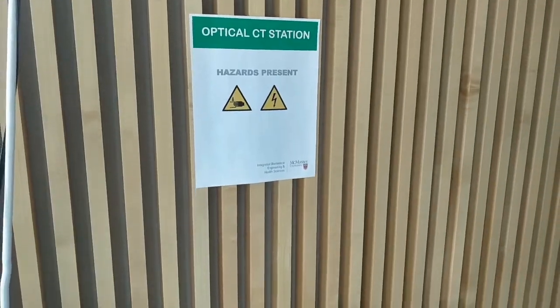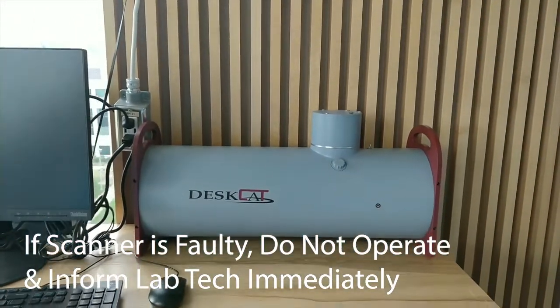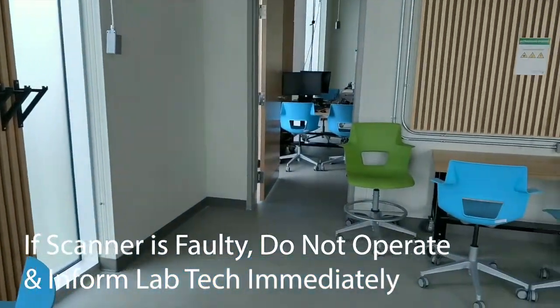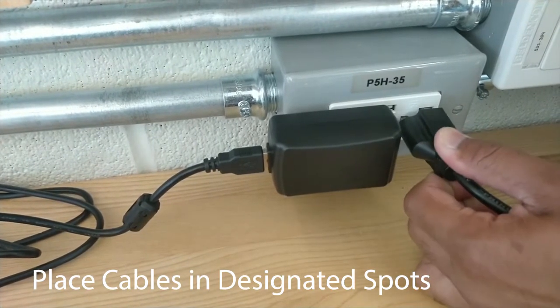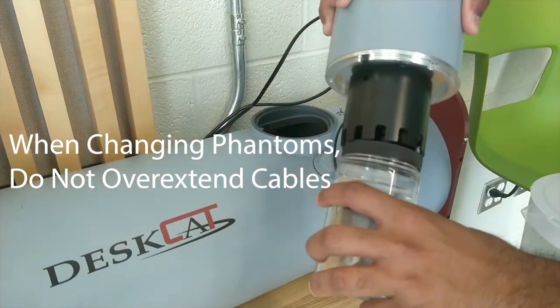Before operating the scanner, make sure that everything is in working condition. If the scanner looks or sounds faulty, do not operate it and inform the lab coordinator immediately. Always place the cables and other electrical cords of the scanner in their designated slots. When changing phantoms, do not overextend the cables connected.